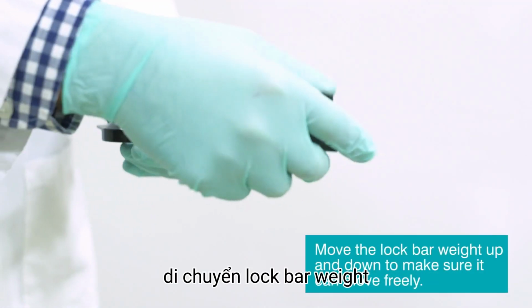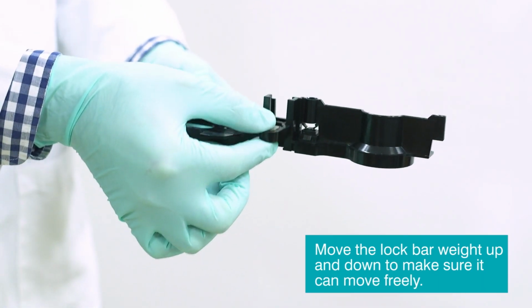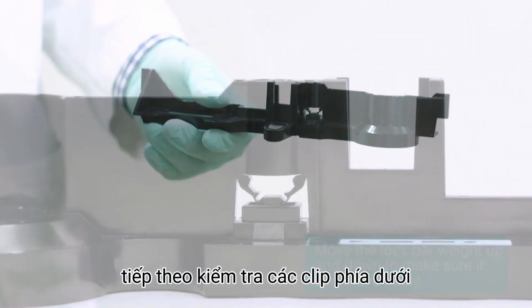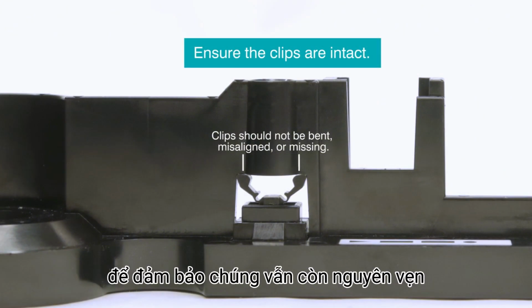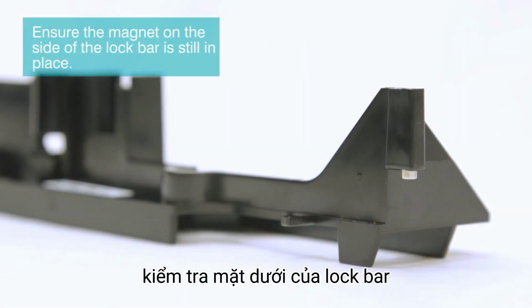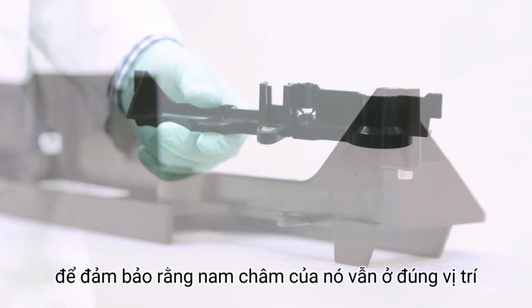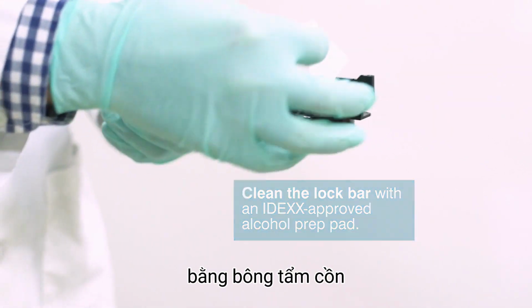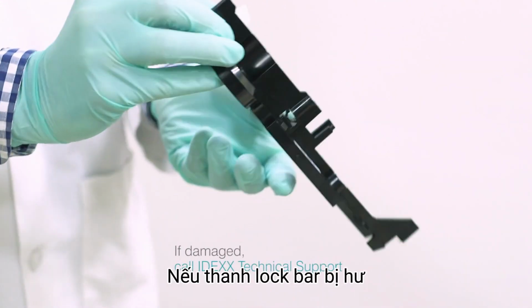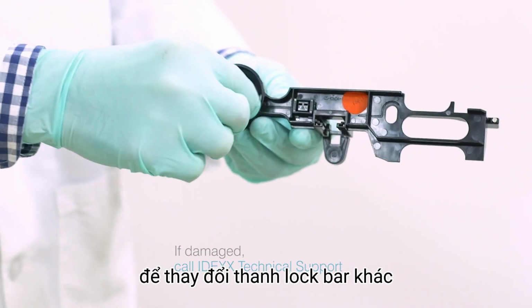Move the lock bar weight up and down to make sure it can move freely. Next, check the clips under the area where the lock bar connects to the robot arm to ensure they're still intact. Check the underside of the lock bar to ensure that its magnet is still in place. Then wipe the lock bar clean with an IDEXX-approved alcohol prep pad. If there is damage to the lock bar, please contact IDEXX technical support to obtain a replacement.